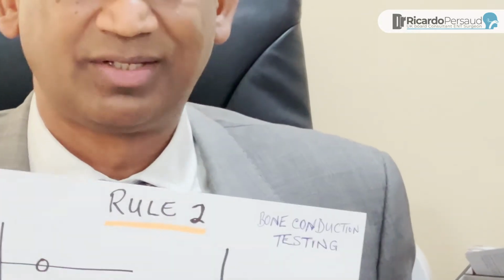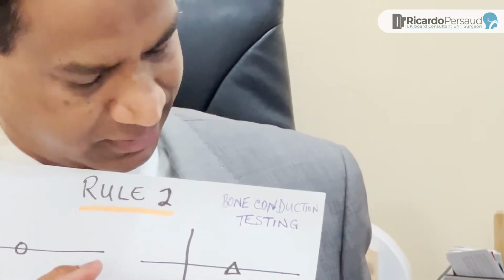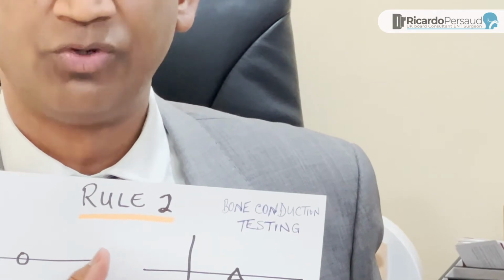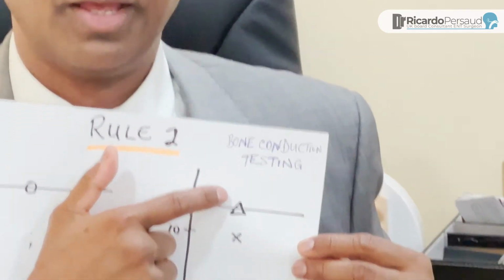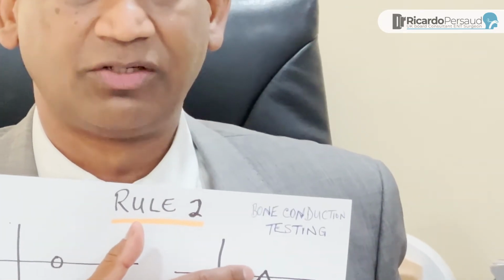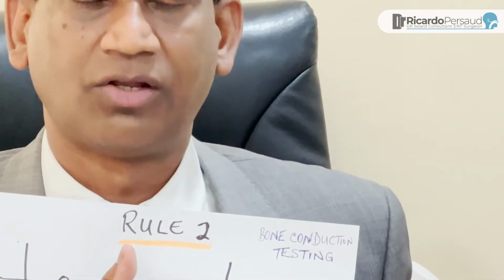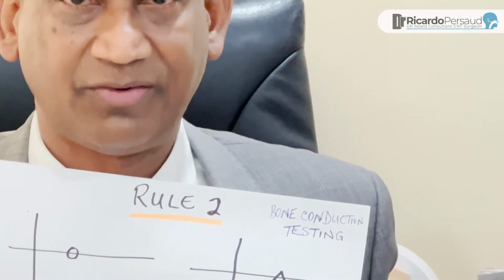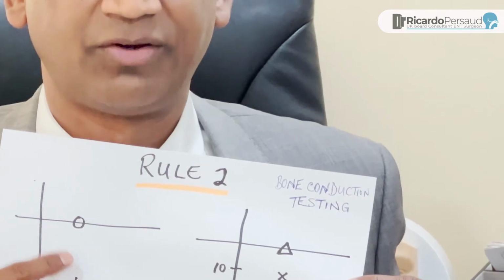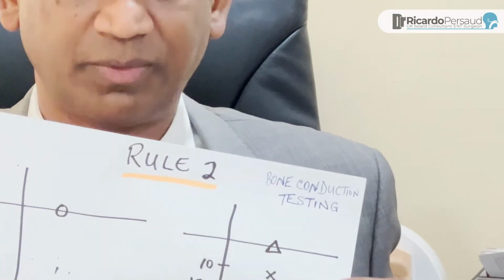Now if you're presented with this audiogram in an exam, it's impossible to tell whether this ear has a conductive hearing loss or a sensorineural hearing loss, because the bone conduction is not masked. Yes? This needs to be masked to determine whether the hearing loss in this ear is conductive hearing loss or sensorineural hearing loss. Again, you will give a sound in this ear, through the canal, which is air conduction masking. And you check back the bone conduction. There's two possibilities you could get. I'm going to illustrate it here.